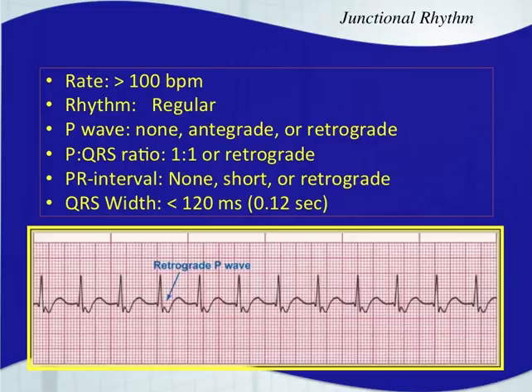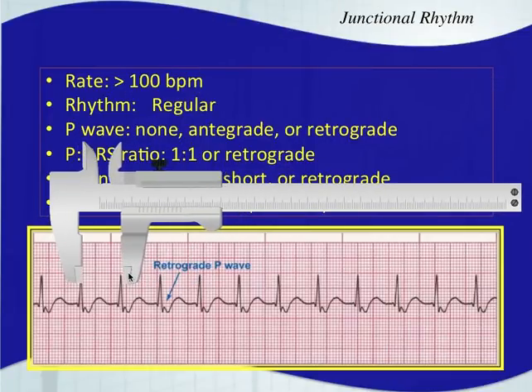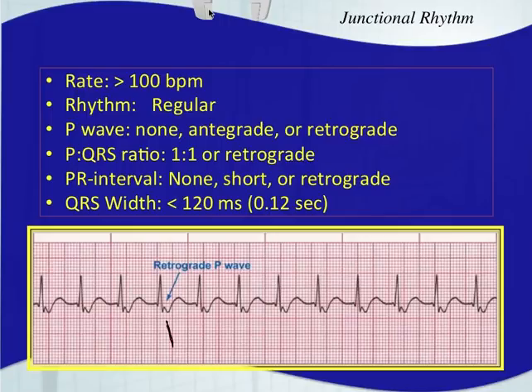With junctional tachycardia, the rhythm will also be regular. Map these out with your calipers and you'll see the rhythm is pretty regular. It has the same rules as other junctional rhythms — the P wave could be antegrade, buried within the QRS, or retrograde. The P-to-QRS ratio shows only one P wave per QRS complex if visible. The PR interval will either not exist, be very short, or the P wave will come after the QRS complex. The QRS width should be narrow, less than three small boxes, which is 0.12 seconds or 120 milliseconds.